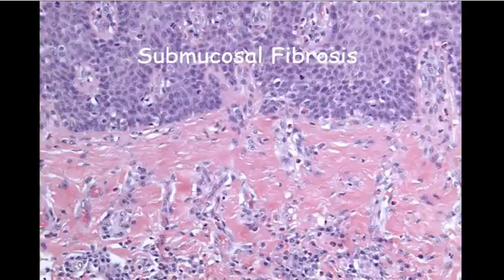And at the very bottom of the screen are actually some aggregates of plasma cells. And just for grins, we got an IgG4, and all those plasma cells light up. So maybe this is actually an IgG4 related disease, as anything that seems to be a stricturing thing seems to have IgG4 plasma cells these days.